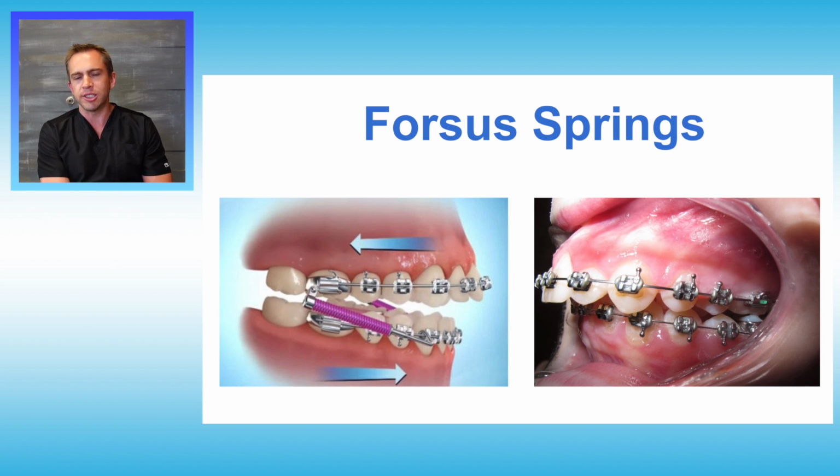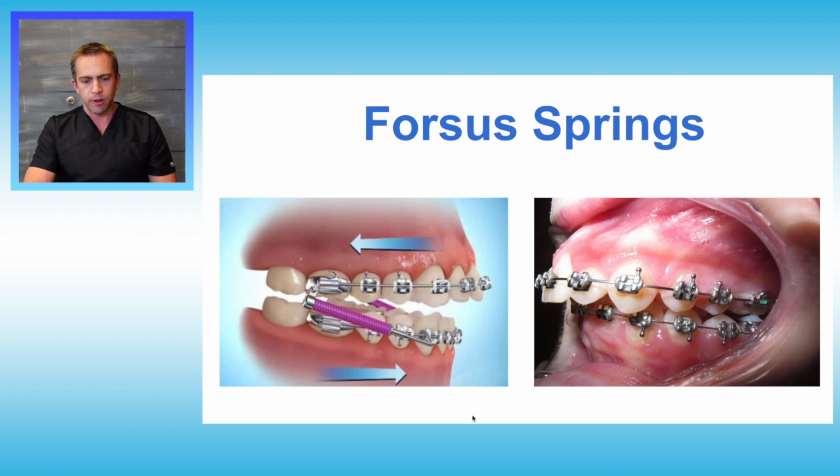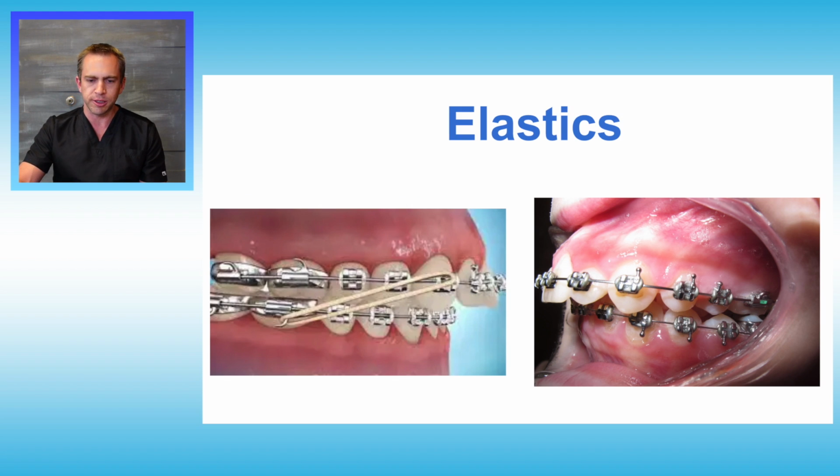Next thing we might consider is a Forsus Appliance or Forsus springs. As you can see in this photo, Forsus springs will work by pushing the top teeth back and the bottom teeth forward. In this patient, you can see her lower front teeth have already been pushed forward, and you can see she's starting to get some pretty thin gums. So one of the side effects of a Forsus spring is it can really push those bottom teeth forward. In her case, we were worried that pushing those teeth forward anymore might lead to some gum recession. So we didn't think this was an ideal treatment plan for her case.